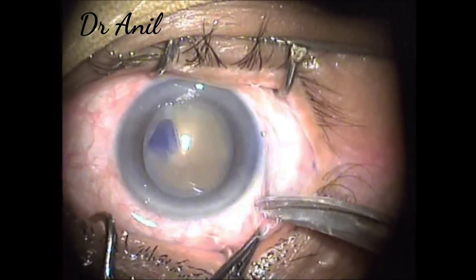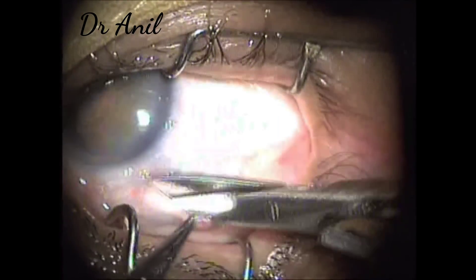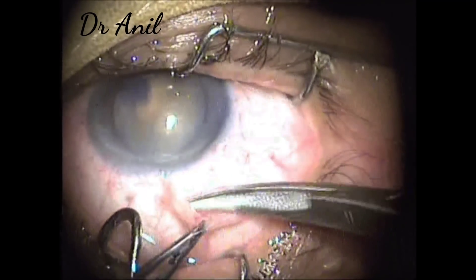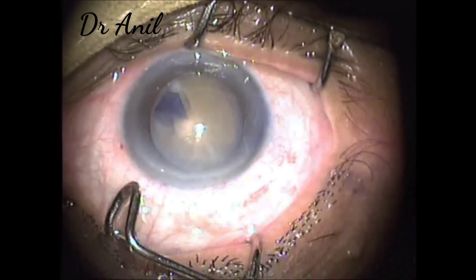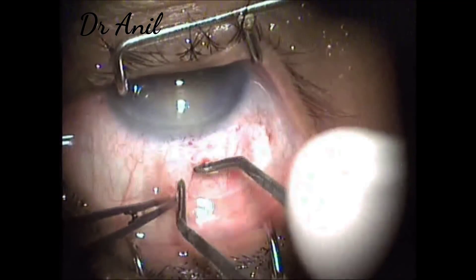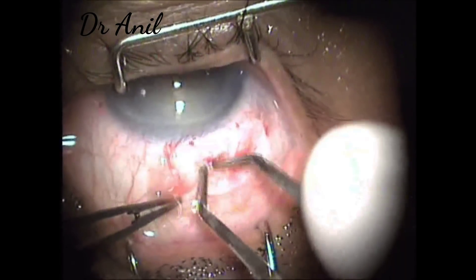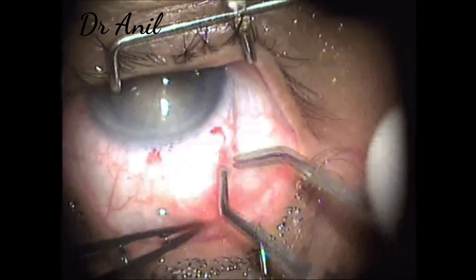A fornix-based conjunctival flap is made, and around 6.5 to 7 mm of conjunctiva is incised. Now cauterization of the vessels is done with bipolar cautery — wet-field bipolar cautery — just taking care to cauterize the vessels only, not charring the sclera.